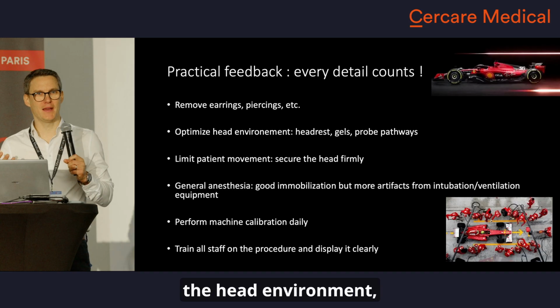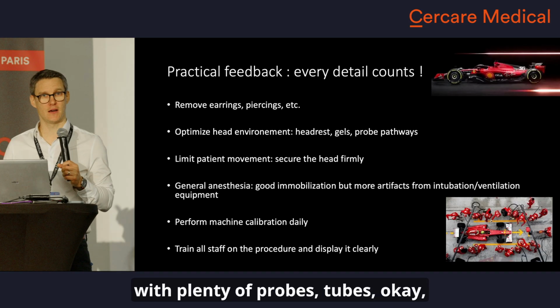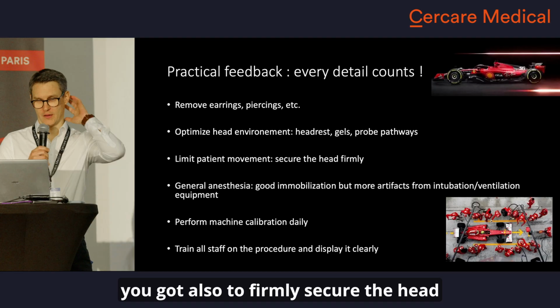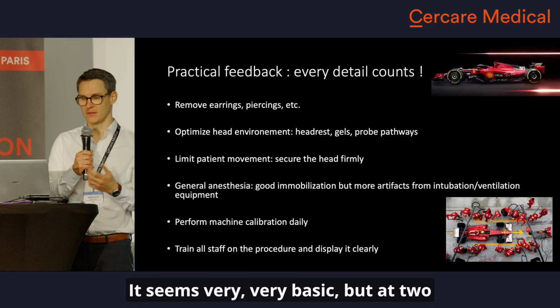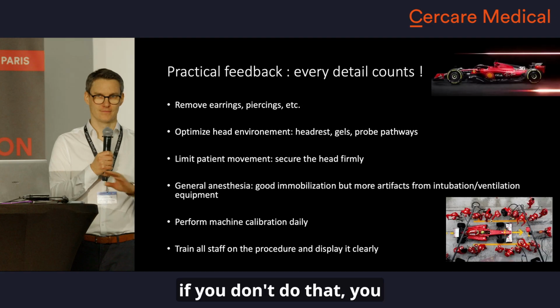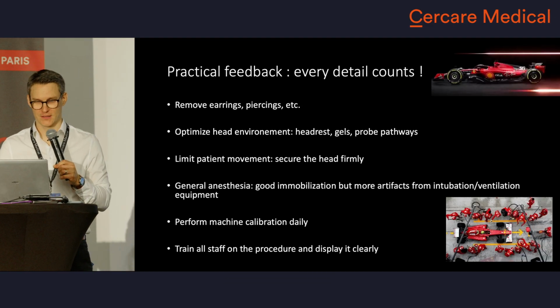If you cannot optimize the head environment, like if you got someone under general anesthesia with plenty of probes, tubes, you've also got to firmly secure the head to ensure the patient doesn't move. It seems very, very basic, but at 2 in the morning, if you don't do that, you will have no CBCT perfusion to interpret.